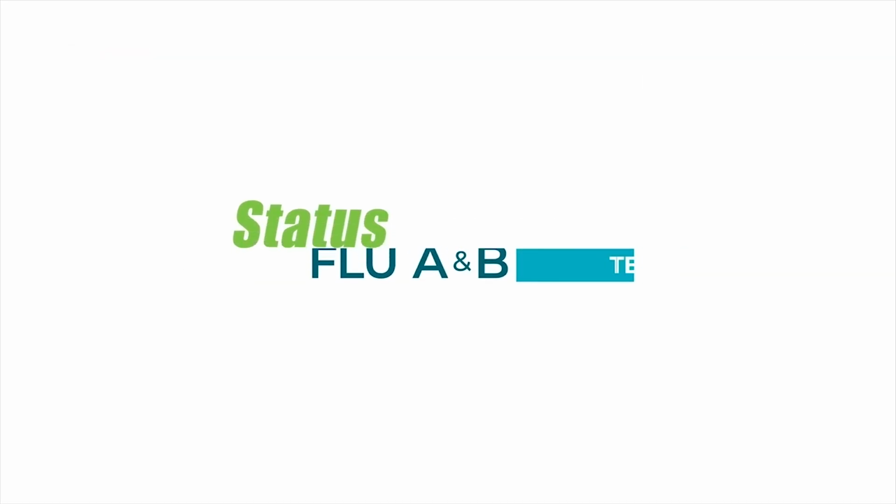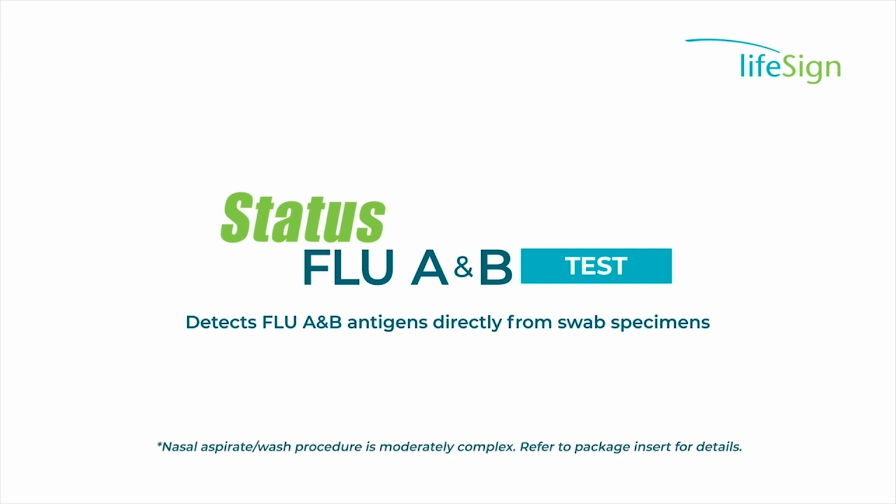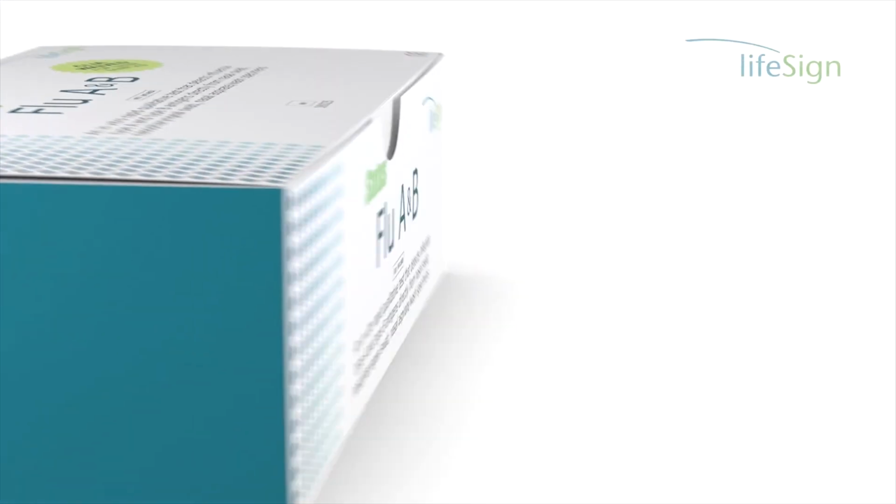The Status influenza A and B test is a CLIA-waived rapid qualitative test that detects type A and B antigens directly from nasal swab, nasopharyngeal swab, and nasal wash specimens obtained from patients with signs and symptoms of respiratory infection. This video demonstrates the nasal swab and nasopharyngeal specimen test procedure.